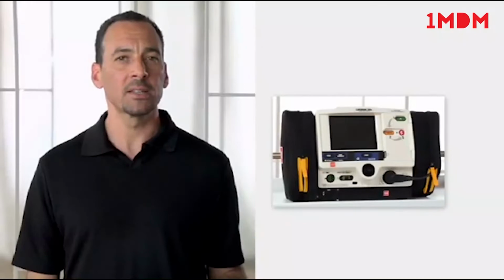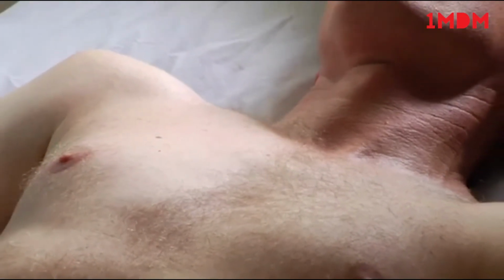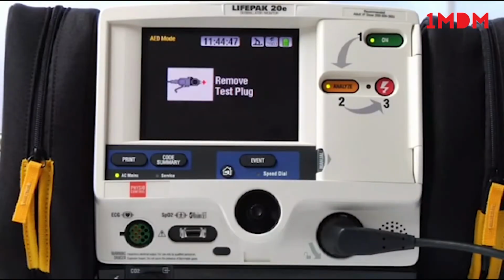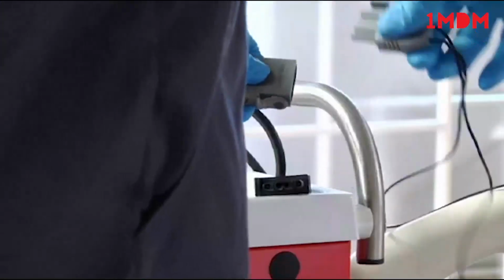Now, if you have everything connected, but you get this message, Connect electrodes, there may be too much patient hair preventing good contact. Remember to remove excessive hair before applying electrodes. If you push the Analyze button, but you get this message, Remove test plug, remove the test plug from the therapy cable and connect the therapy electrodes.